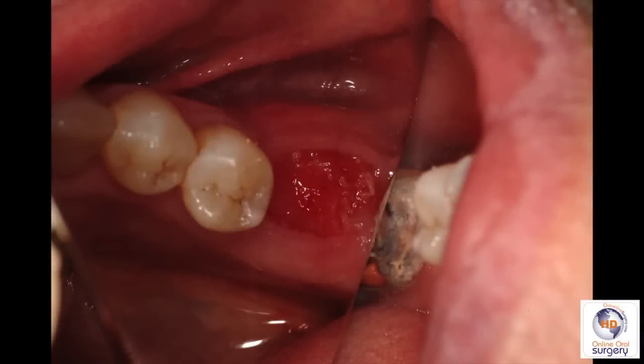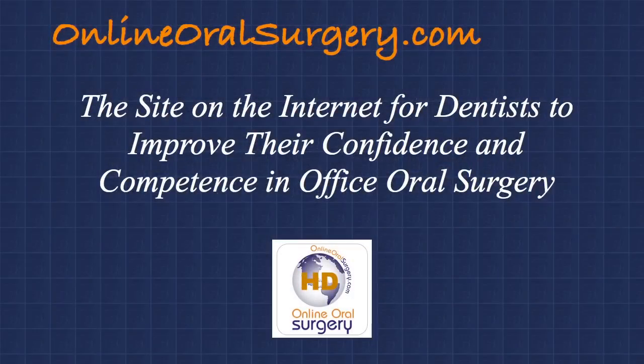Here's our patient immediately after removal of the membrane at six weeks post-op. What happens is you get a layer of granulation tissue that forms between the graft and underneath the membrane, so when you remove the membrane you've got this nice layer of granulation tissue that's protecting the graft. Then within a few weeks to a month after the membrane is removed, you find that it has epithelialized over very well with nice healthy keratinized mucosa — which is just ideal for when you're going to place the implant.